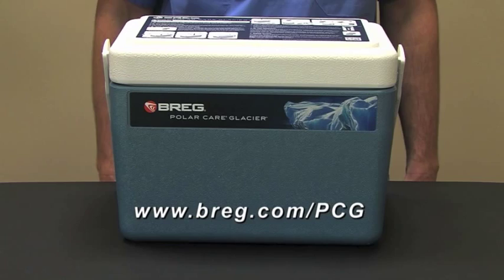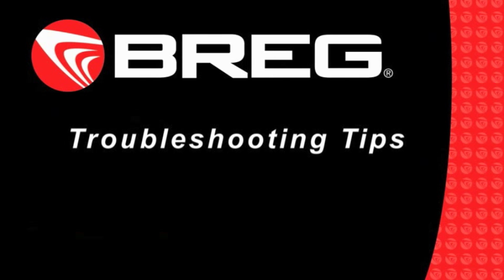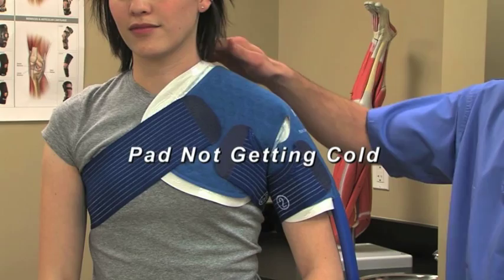Breg's PolarCare units are very reliable. With proper setup and maintenance, our customers experience very few difficulties. In the event you run into an issue, let's go over a few tips. If at any point the pad is not getting cold, take the following steps, one at a time, until the issue is resolved.